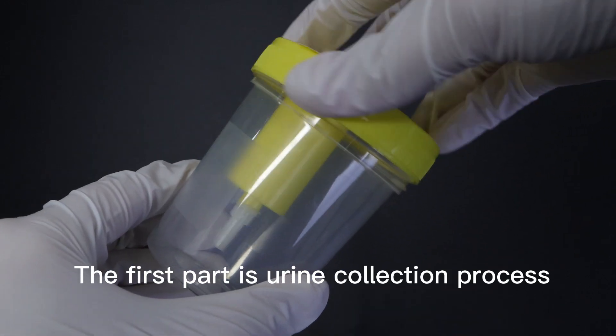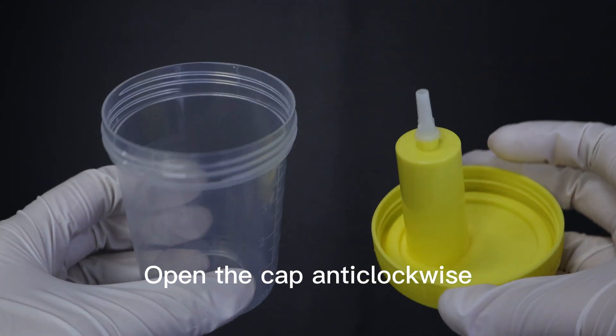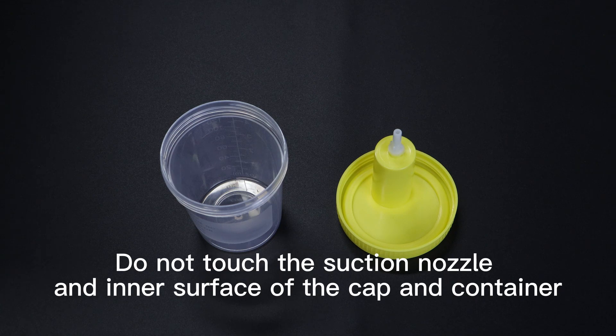The first part is the urine collection process. Open the cap anti-clockwise. Do not touch or remove the label. Put the cap on a clean surface. Do not touch the suction nozzle or the inner surface of the cap and container.